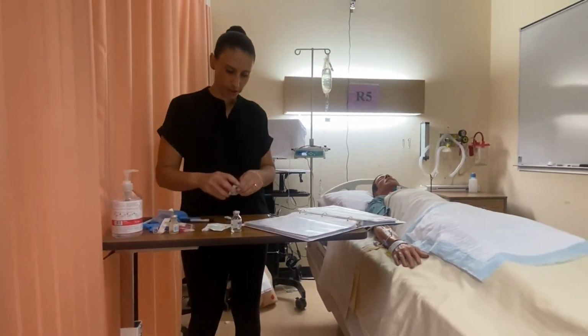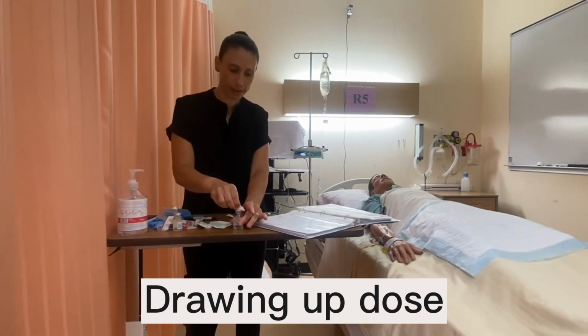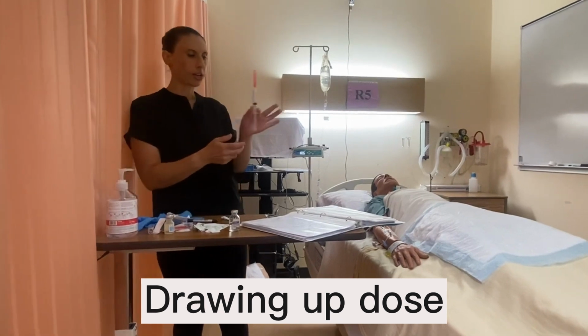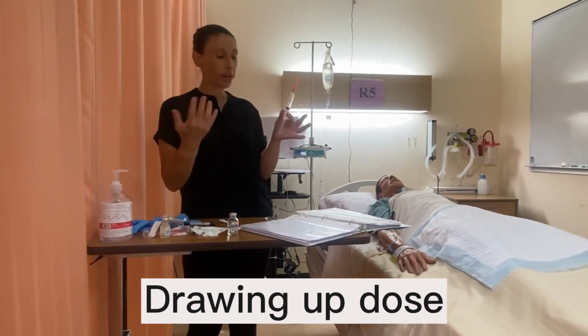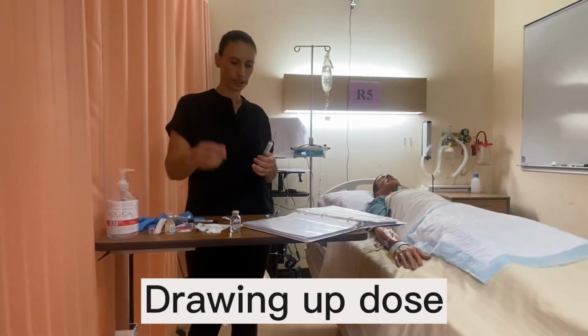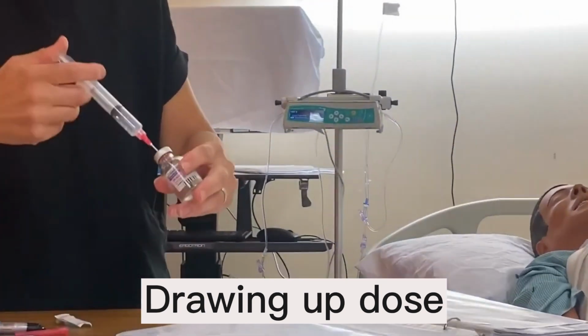So I'm gonna take another alcohol swab here. And because I might have contaminated it with my hands while I was swirling it, okay, we're gonna take our syringe, and you can use the same one, or again, you can use a 20 ml syringe, that's fine. Okay. And we're gonna instill our air.